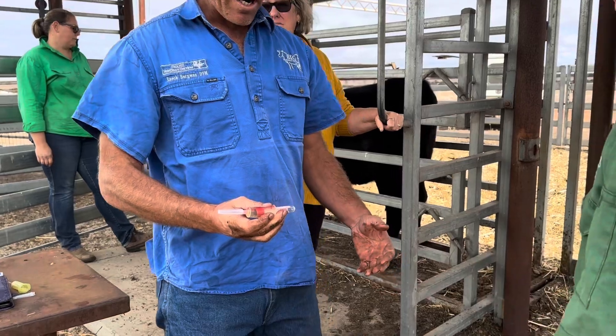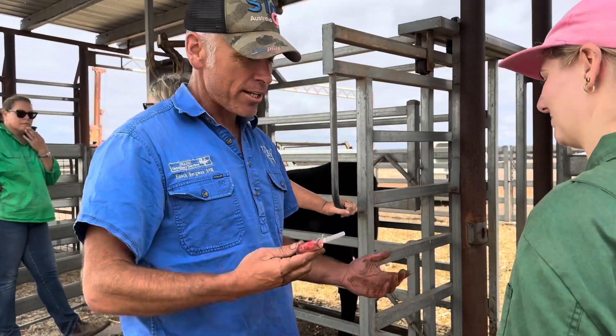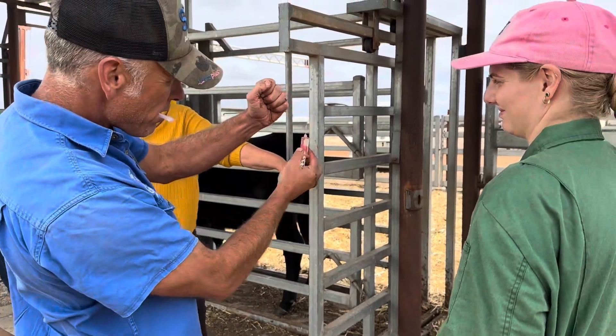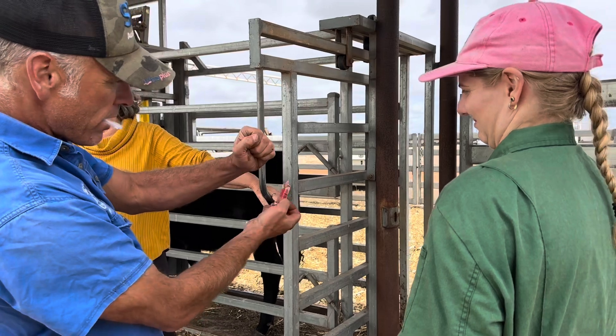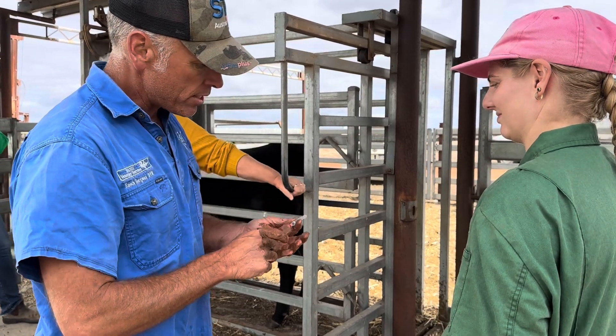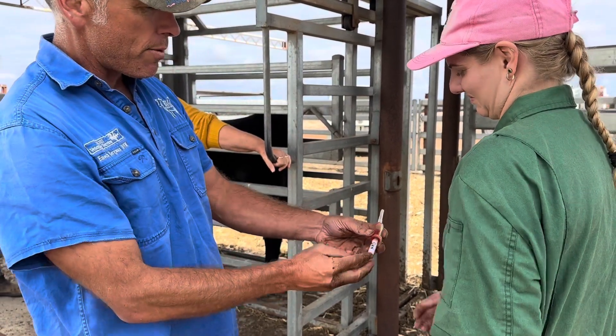What I do when I'm going in is — you can get blood over yourself that way, so carry it any way you want. Project the tail. Cap off. In the middle. Pop it on. Redirect to get blood. Pop it off. Put your needle back on. These also make it easy to unscrew it. There you go, my friend.